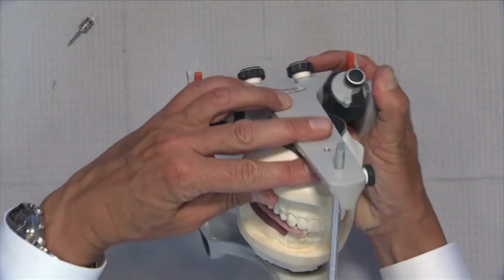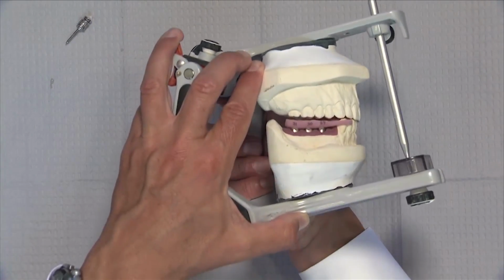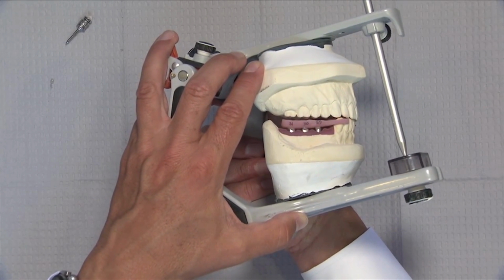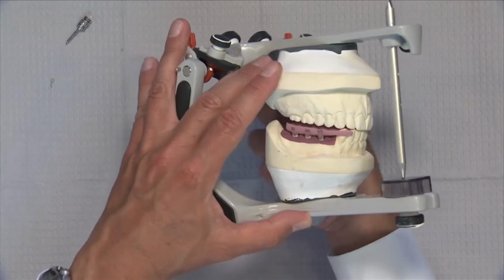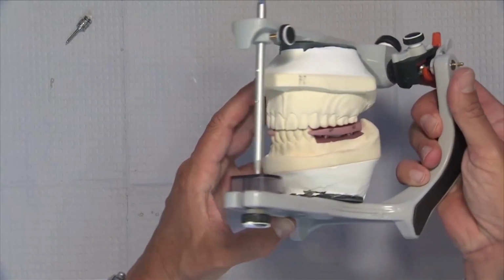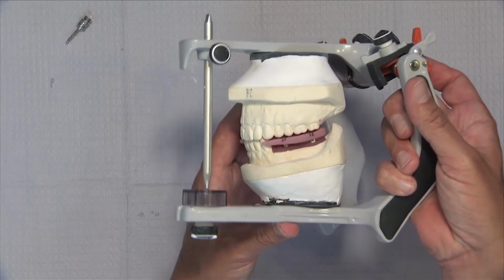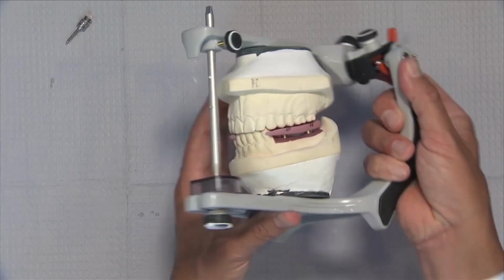And again, when the patient bites together, I've already ground that so that there's no contact at all between the opposing teeth and that bite plane itself. Like I mentioned, when it comes back from the laboratory, it's got indentations from those opposing teeth, and there's a chance that it might be right on, but there's probably a better chance that it's not quite right on. And if it's not quite right on, just grind all that material away so you can see daylight between the opposing teeth and the bite registration itself.